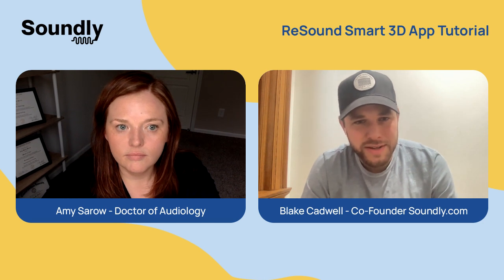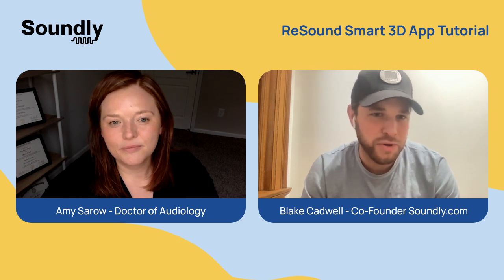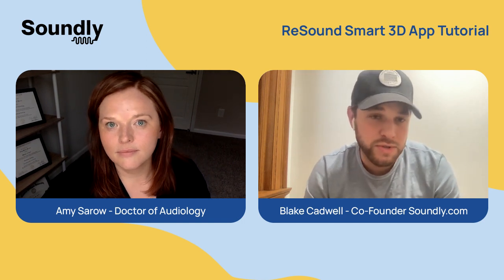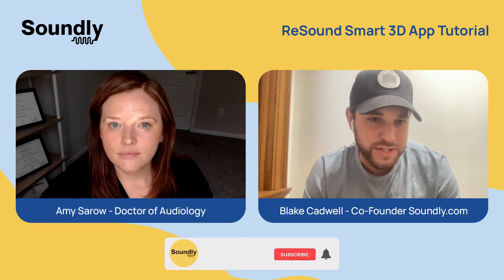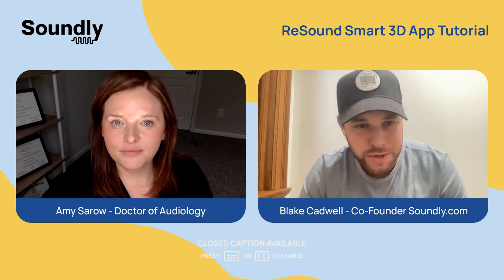Hi, everyone. My name is Blake Cadwell, and I'm joined by Dr. Amy Saro. In this video, we're going to take a deep dive on the ReSound Smart 3D app. We're going to take you all the way from the process of pairing into some of the key features inside of that app. We'll also touch on the other app that ReSound offers, which is focused on tinnitus. Amy, I'll pass it over to you to take us through this step-by-step on how the ReSound Smart 3D app works.